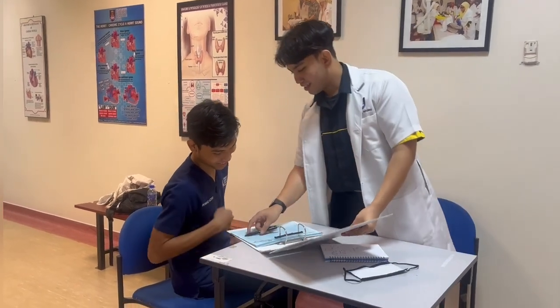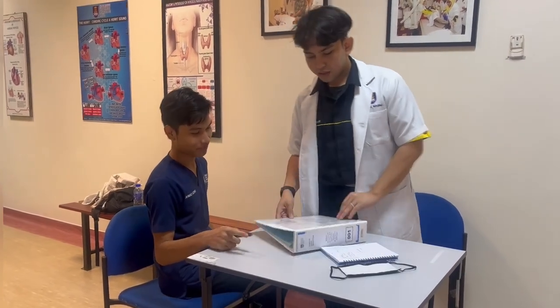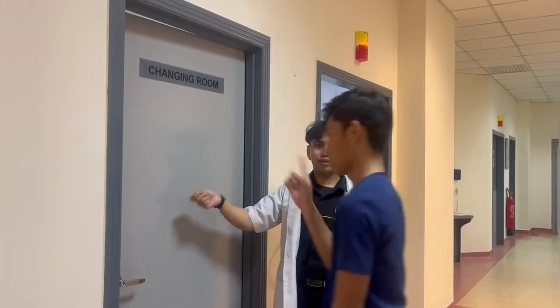If true, ask the patient to sign the consent form while asking if the patient really fasted for at least 4 to 6 hours prior to the examination. Ask if he already took the laxative that the nurse gave, and then explain briefly to the patient what we are going to do today, so that he will understand it and the procedure will go more smoothly. And then ask the patient to change the outfit at the changing room before the examination.